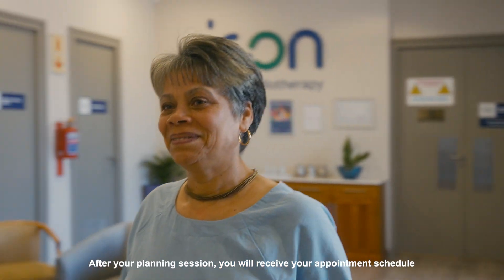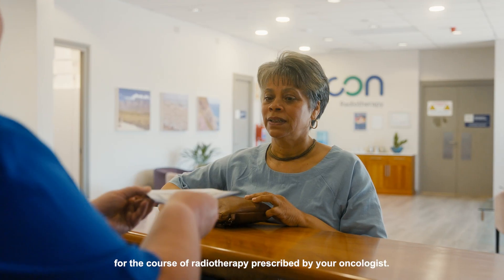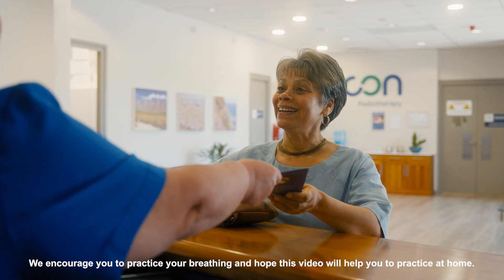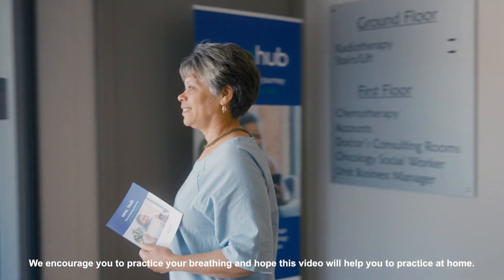After your planning session you will receive your appointment schedule for the course of radiotherapy prescribed by your oncologist. We encourage you to practice your breathing and hope this video will help you practice at home. Thank you.